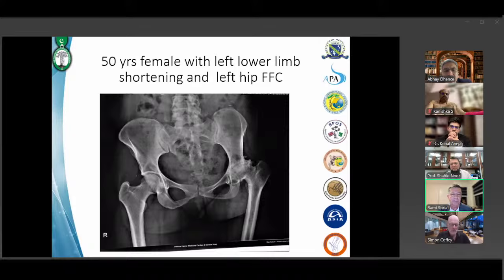In terms of workup, I'd use my software program, but I'd also use a CT as part of the workup just to identify patient's anatomy. I'd want to see a lateral projection as well. So that's all part of preparing myself for surgery. The sort of implants I'd be using, I'd certainly, in a 50-year-old, have my standard implants on hand to see if I can use them. I can't see anything in the particular film you're showing me to say that I couldn't use a standard hemispherical acetabular component, possibly with 1 or 2 screws if needed.